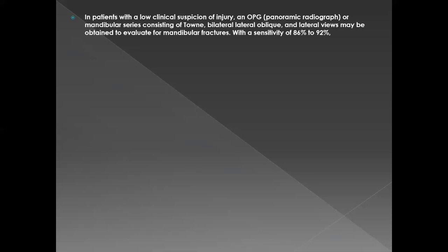So let's see what this report says regarding radiography of the mandible. In patients where you have a low clinical suspicion of injury, a patient may be ordered an OPG or a mandibular series. So you have two options over here. You can either order an OPG or you can order a mandibular series.